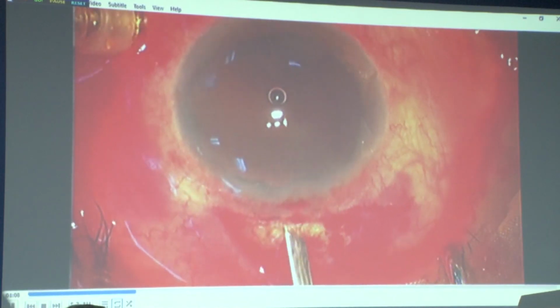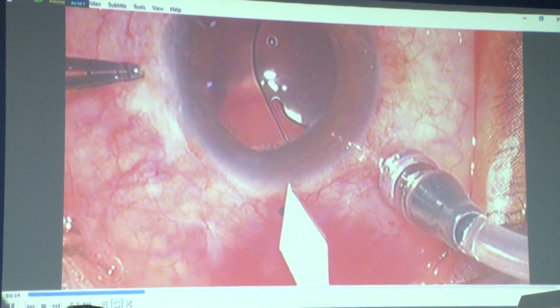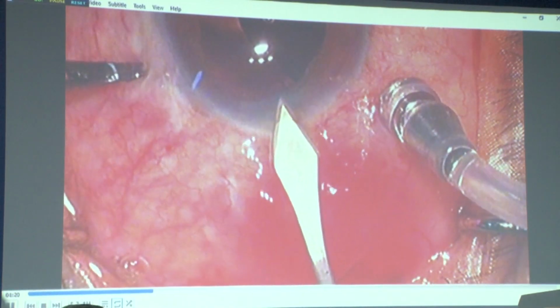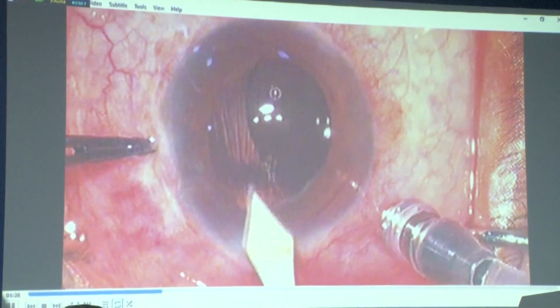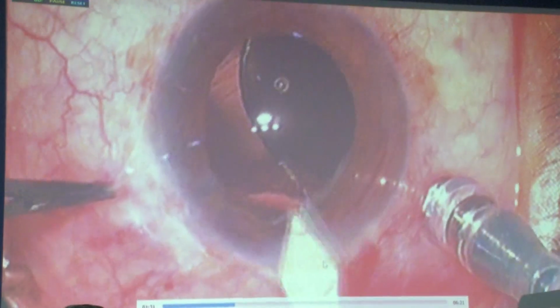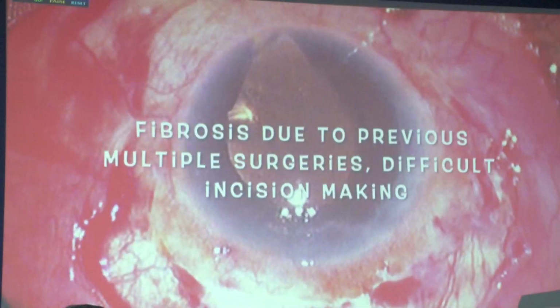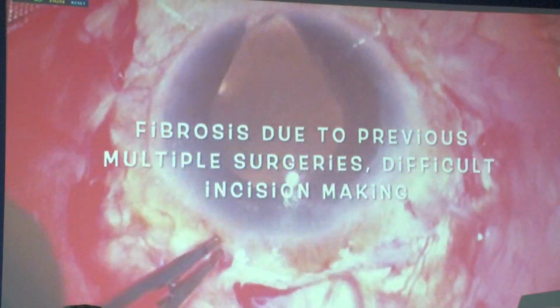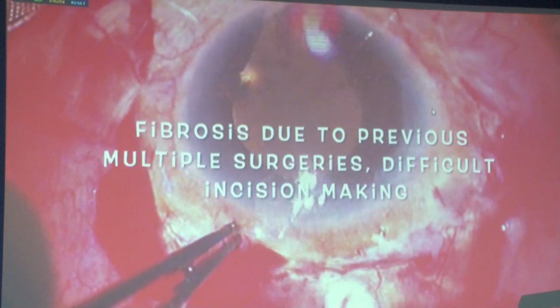There was a pupil dilation, and this patient had already had an SFIOL. He presented to us, and there was superior fibrosis. So I planned to go for a clear corneal temporal incision to explant this IOL. So incision is not only the easy SICS incision; you can get these patients also, who were previously operated cases. You can see the knob here. This patient has already undergone 2 secondary IOL surgeries and was implanted with a CMT flex IOL. It was a small, colobomatous eye, and all throughout almost 270 degrees the fibrosis was there. The cornea was already involved because of the previous surgery.